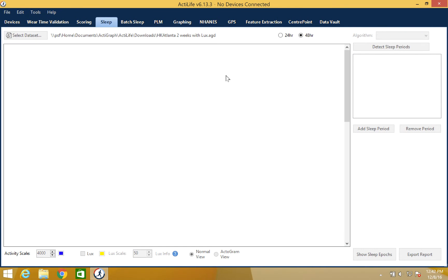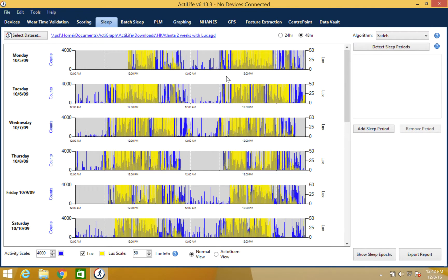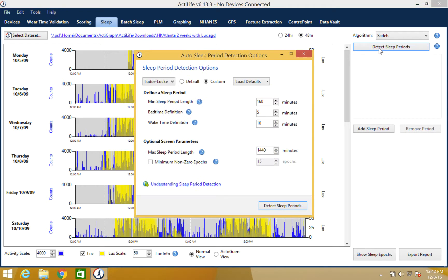The first feature that we will cover is the detect sleep periods, located in the top right of the screen. In the basic ActiLife program, in bed and out of bed date and times must be entered manually for each sleep period. This feature saves the user time and resources by automatically detecting the in bed and out of bed times.